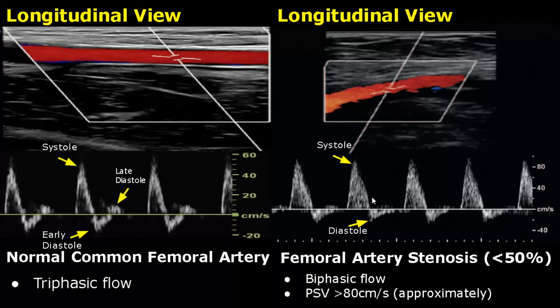No forward flow in diastole is seen. Also, the peak systolic velocity is increased — it is more than 80 centimeters per second here.